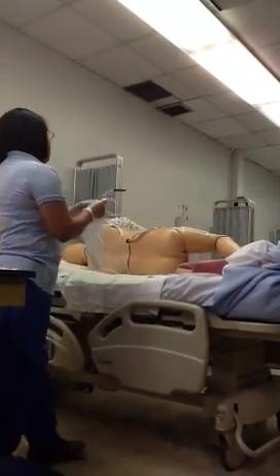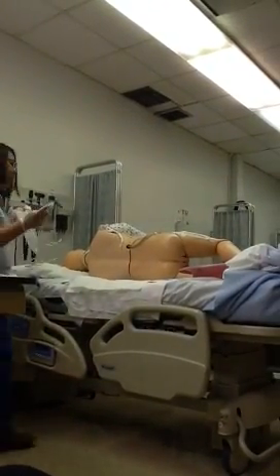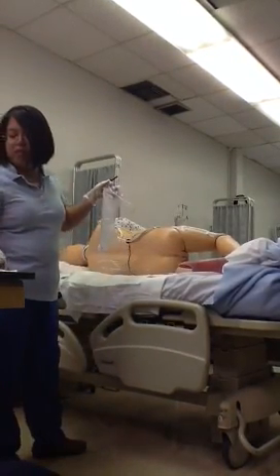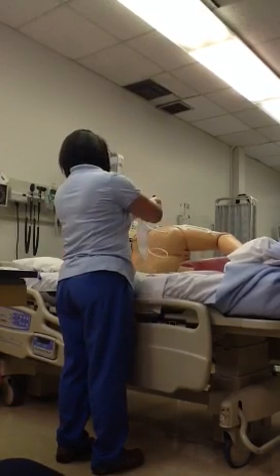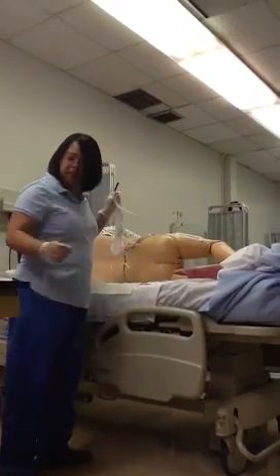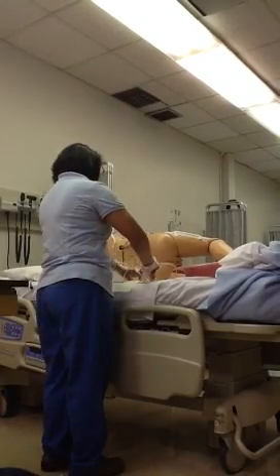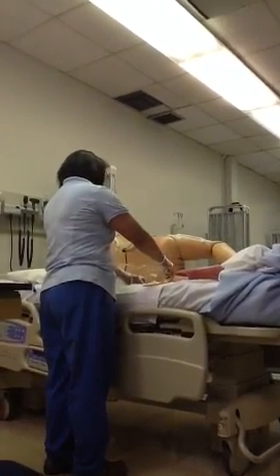Mm-hmm. All right. Once it's there, then I'm going to go ahead and tell my patient, okay, here comes the tube, because he knows what's about to happen. So I usually will take extra lubricant, okay, and about 3 to 4 inches again of this lubricant. Do they come in different sizes? No.